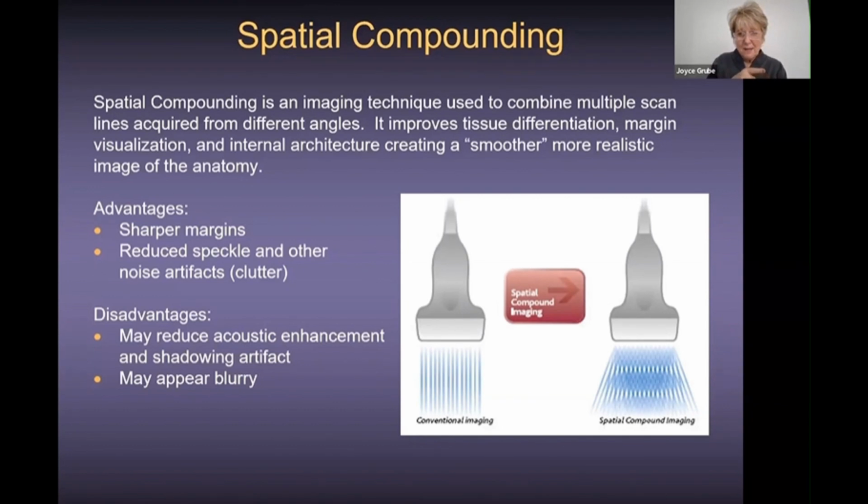But on board exam day, the board exams can't call it crossbeam if you're not a GE user. So they're going to call it spatial compounding. So make sure that you know which one is your spatial compounding button.